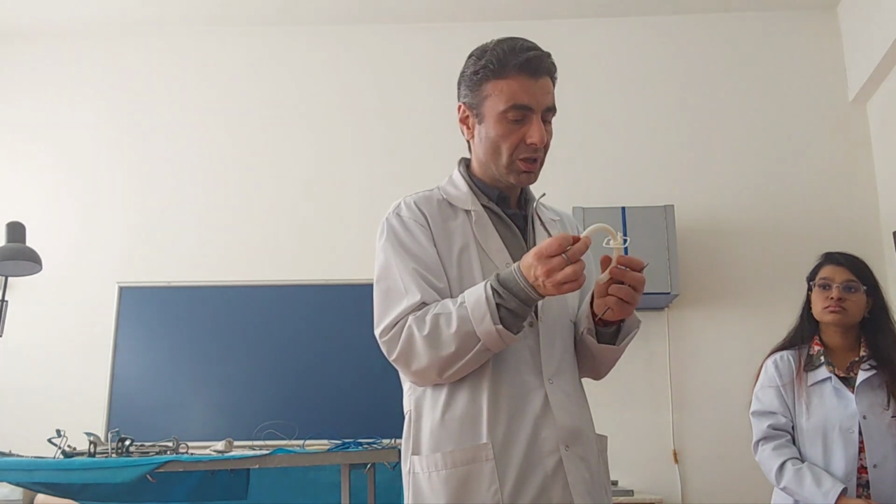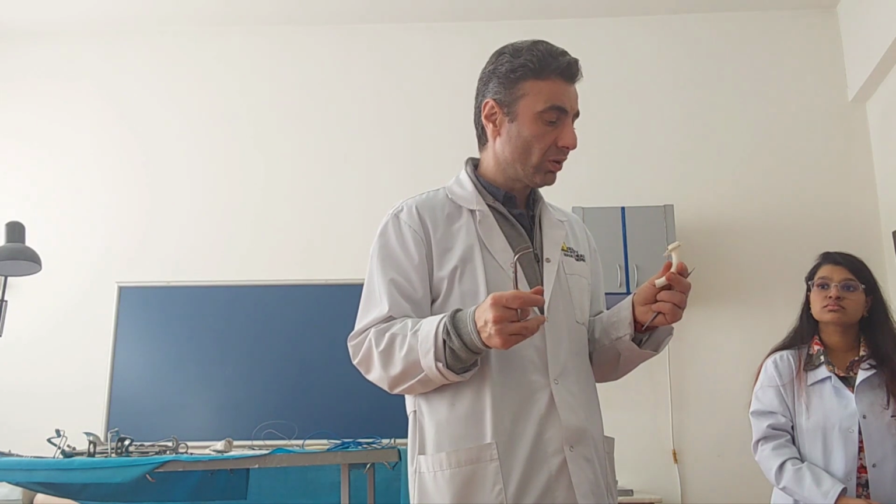now I will use the third instrument, which we call tracheotomic tube. I put it firstly in horizontal position, insert it between the branches of Trousseau, then I turn it vertically and fix it on the neck through this shield by apertures using the bandages. And sutures will be applied in the wound up to this tube. Tube has 2 parts, inner tube, outer tube, and the lock between them.